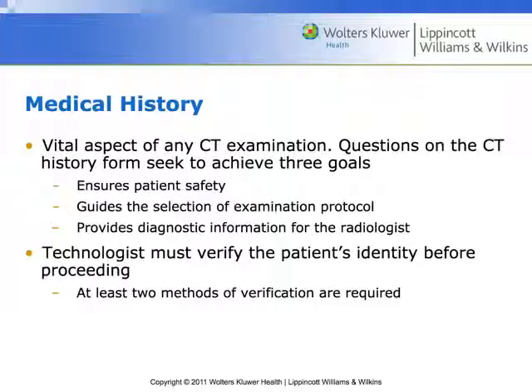So I'm never sure that I'm doing the right thing on this patient until I sit down, I've got them all wired up, hooked up, and I'm about to hit go on the contrast injector and the scanner. At that point, I'm 110% certain that I'm doing what I need to be doing. But every point up to that, I'm not sure. Maybe we don't need to be doing a CT today, right? I think there can be a lot said for shipping patients to other places.